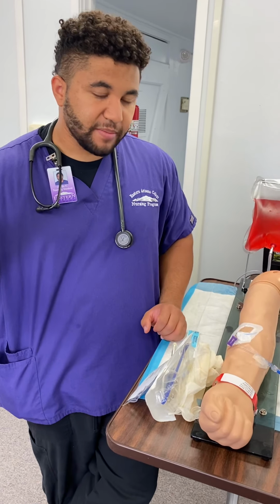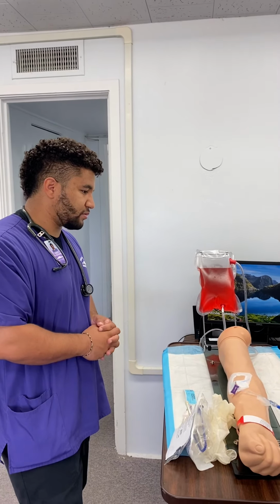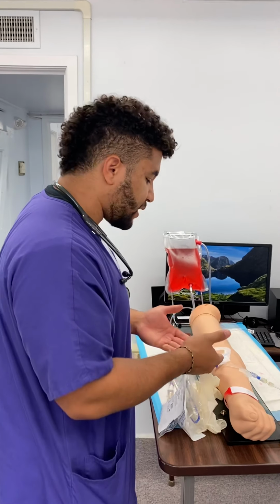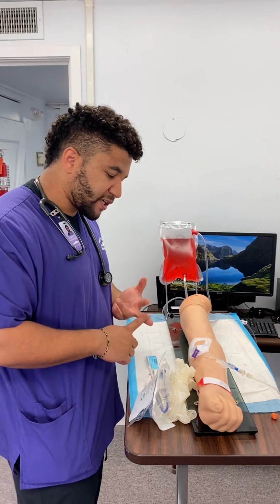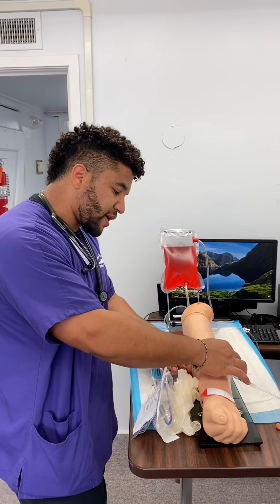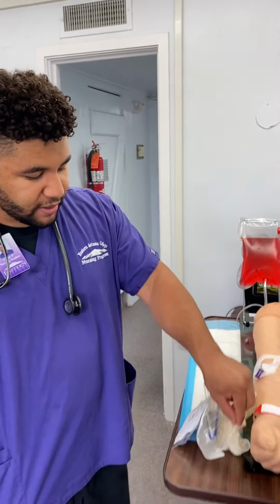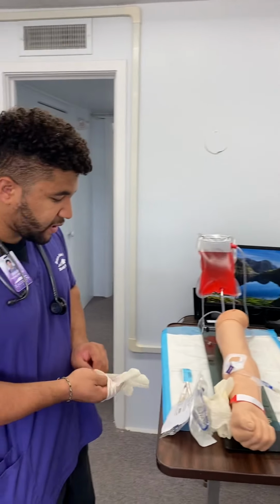And at this time, we would also ask about allergies. Mr. Waters, do you have any allergies, especially to antibiotics? No allergies? Okay, great. So now that we've done that, we could take a moment to inspect the IV site. We want to make sure that there's no inflammation, infection, infiltration. You can even palpate just around the IV site and ask them if there's any tenderness. Is this tender at all, Mr. Waters? No? Okay. So we know that the IV is still good because we currently have some solution running through it, so it is patent.